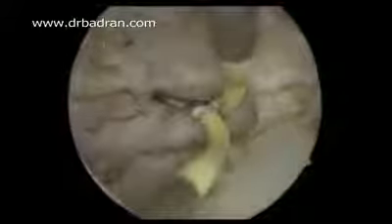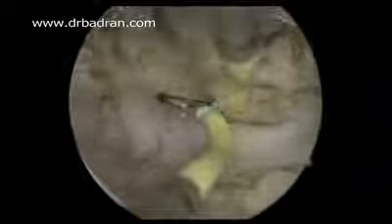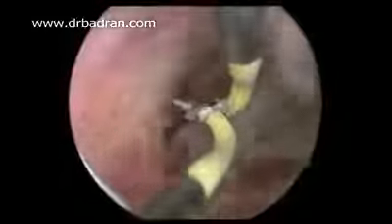You can see the whitish fibers of the septum, and beyond it is the reddish, brownish muscular tissue of the uterine wall, which indicates that the septum has been more or less completely resected.